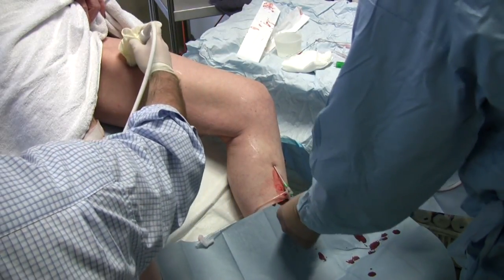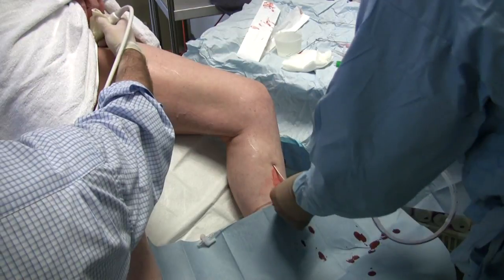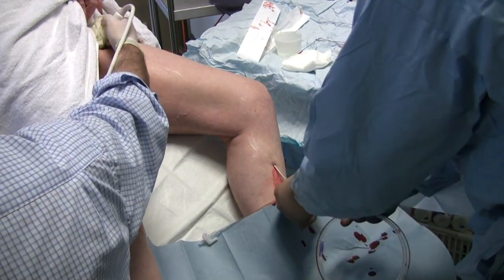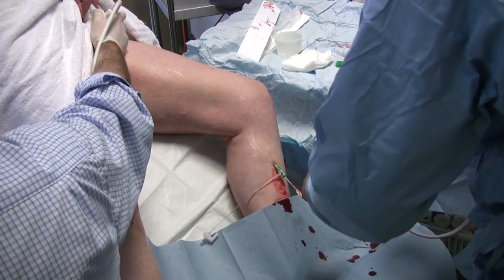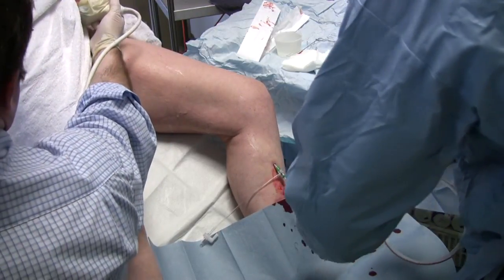As you can see, the catheter slides up over the wire, is tracked by the ultrasonographer to the groin, which is the most common site of leakage for varicose veins.